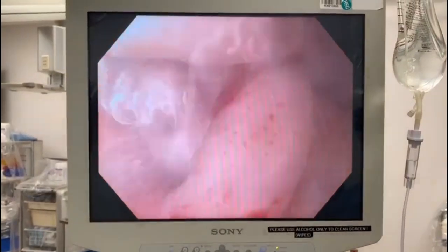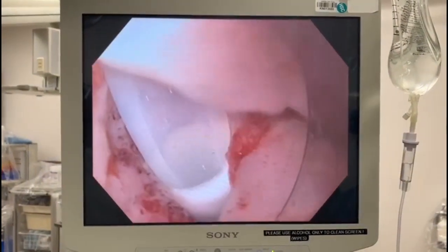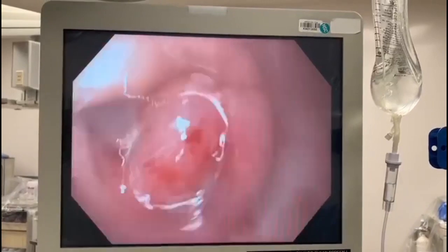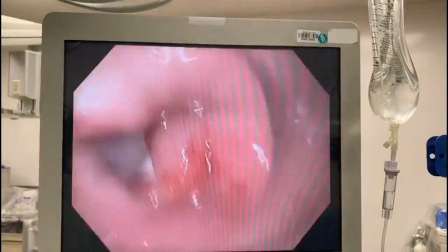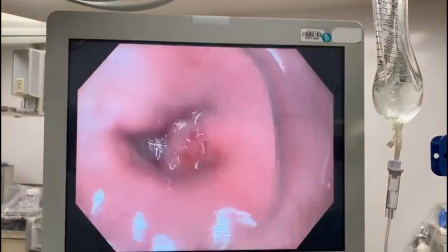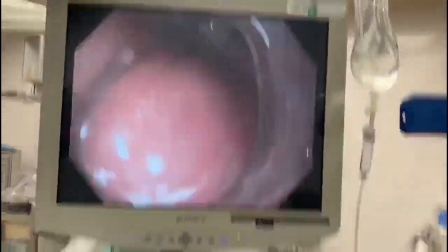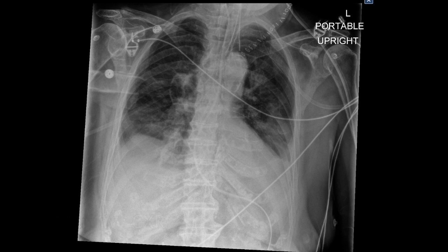This is the final appearance of the drain with the perforation on the left and the true esophageal lumen on the right. The postoperative radiograph confirmed placement of the drain within the mediastinal cavity.